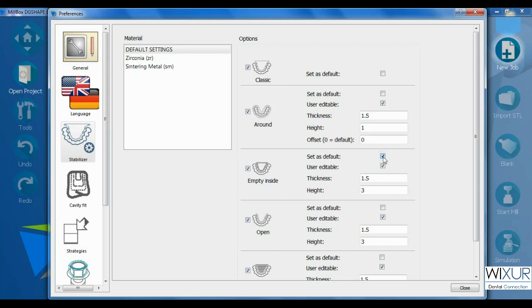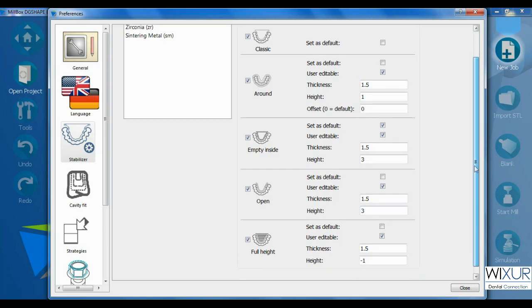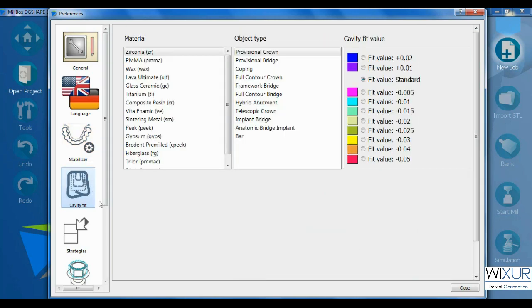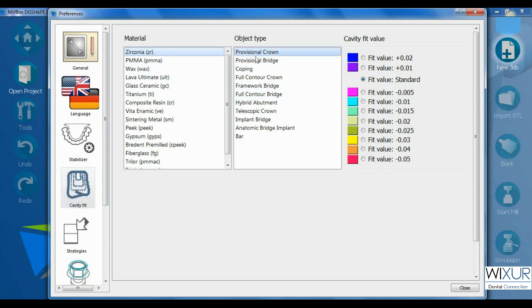And also one of these stabilizers can be chosen as default. The cavity fit for every type of restorations can be set here. Fit values are discussed in a separate video.